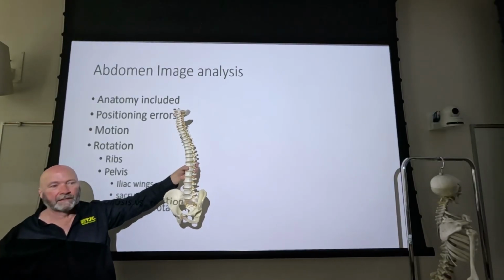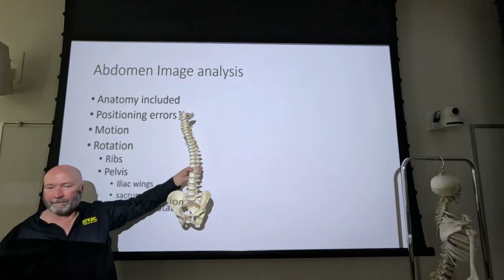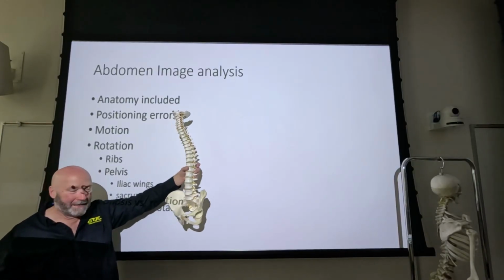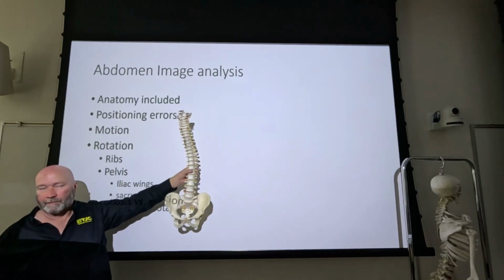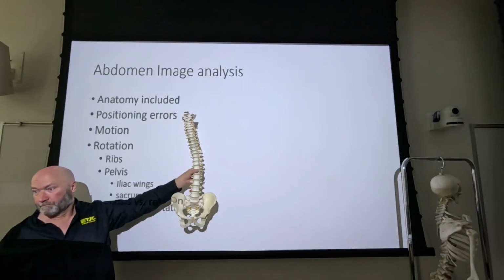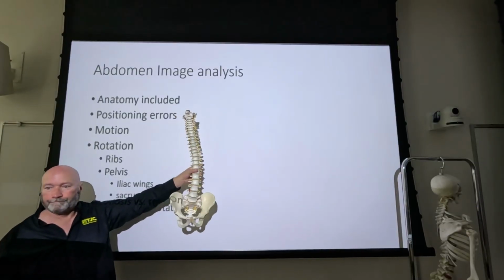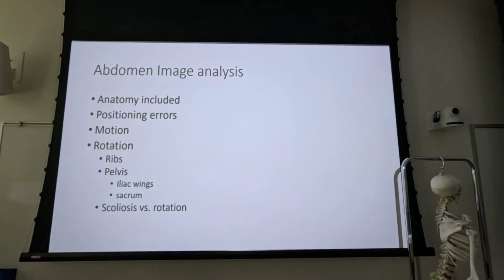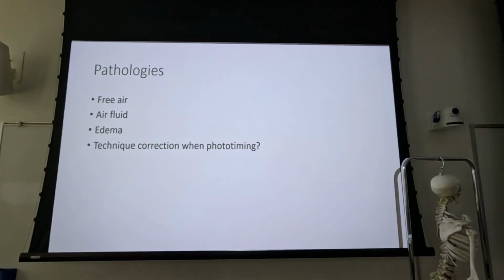Maybe it's scoliosis. Again, if you get scoliosis, you might very well not be able to get rid of any kind of rotation. But basically what we're looking at is what we probably end the semester with. That's Judet views. It's pretty much what we're looking at here, right? Just oblique of pelvis. So that's primarily what you're going to look at.